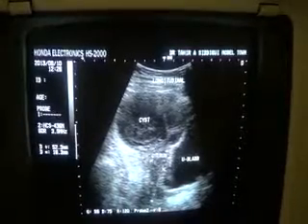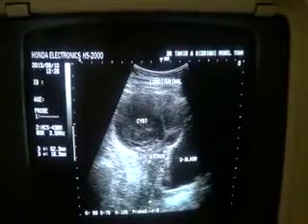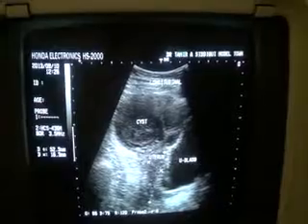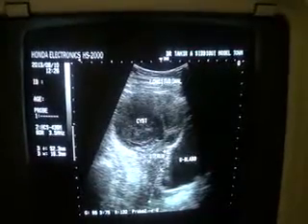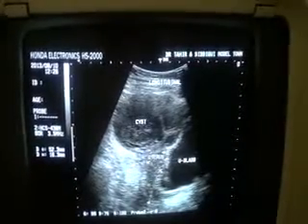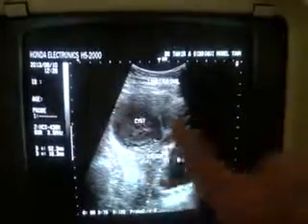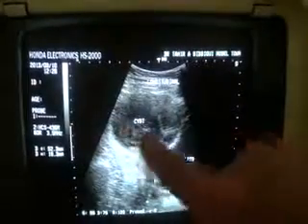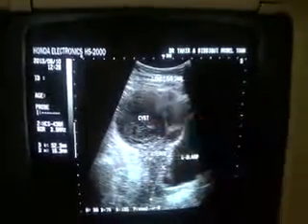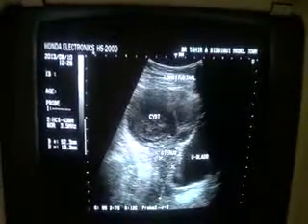So I will say that this is a case of a relatively small sized uterus with a cystic area in the region of the right adnexa extending anterior to the fundus of the uterus, full of echogenic areas layered out within this cystic area, with the possible differentials that I have narrated.